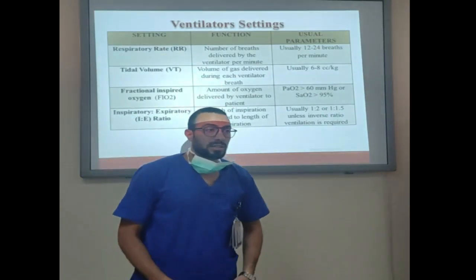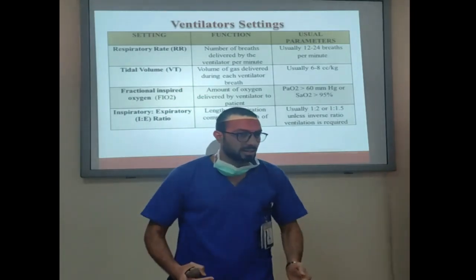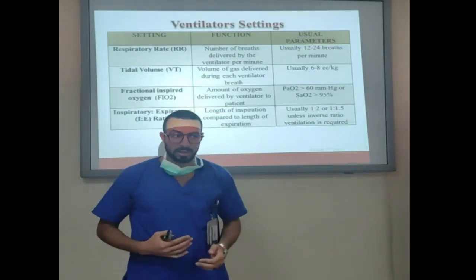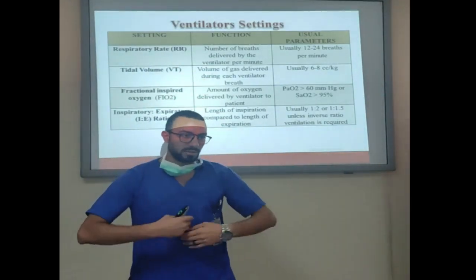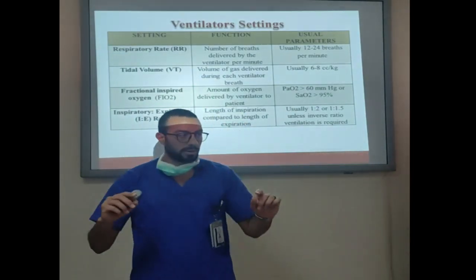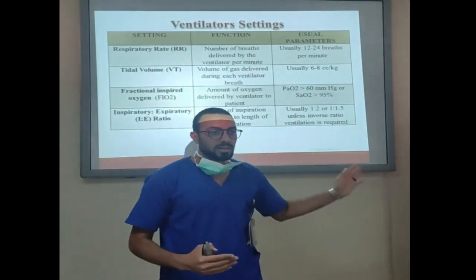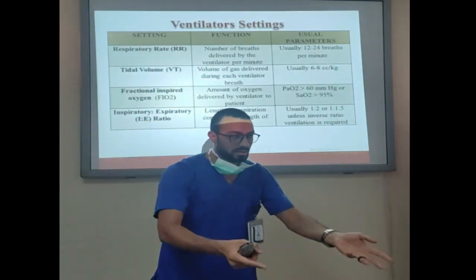So about the ventilator settings, it's very important to know them. It will ease understanding of the modes, because modes are very complicated. I'll just tell you the basic modes, because we have too many modes. In this lecture we will talk only about the basic modes that we can use in the ICU. Anyway, you should know these settings to understand the modes.